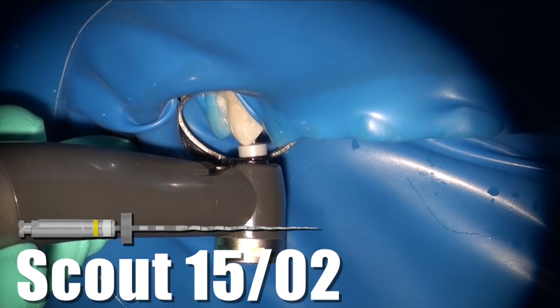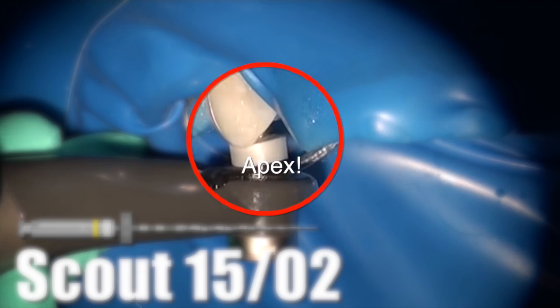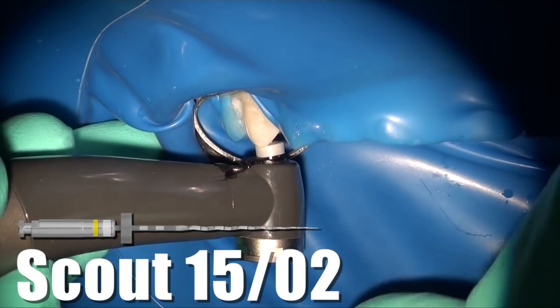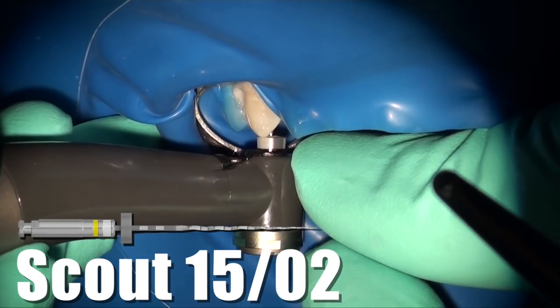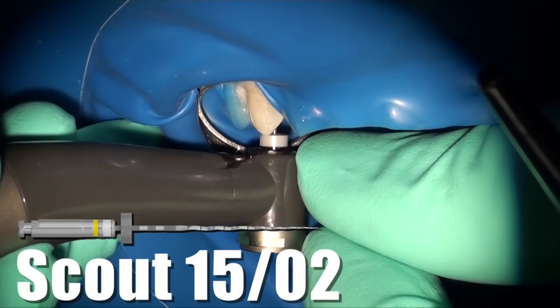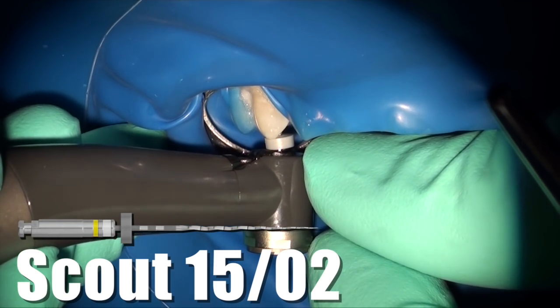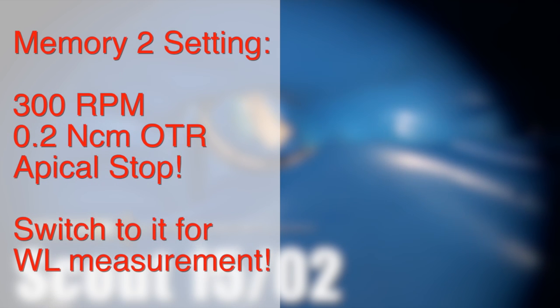The EndoSync AI has been connected and I'm using three motion — the file proceeds to go down on the buccal and then it stops, which means it has reached the apex. I reconfirm by pulling it back out and going down again, and if it stops at the same position a few times then that is the apex — a fairly accurate reading. The key with apex locators is to make sure you don't have any short circuits. On the buccal we confirm that it turns out to be 24 millimeters.